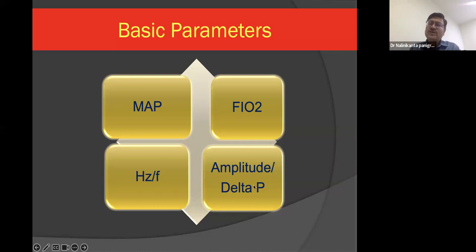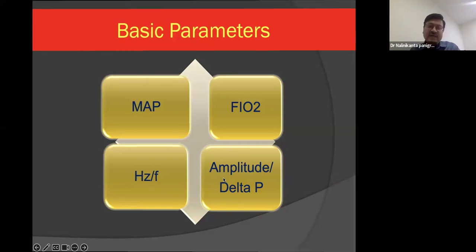And amplitude is the wiggle factor. We'll see in the video how the wiggle works. The wiggle factor is different in comparison to a conventional ventilator. In a conventional ventilator, with each breath the chest expands, and with each expiration it comes back to baseline. But here, amplitude is the wiggle factor: there's a constant chest wobble, with probably lesser movements, which helps with ventilation and dispersion of the gas into the lungs. So these are the amplitude or ventilation factor, the frequency or rate factor, and the mean airway pressure. These are the three things we can directly choose in the HFO ventilator.